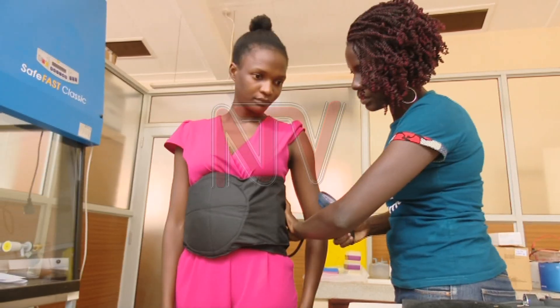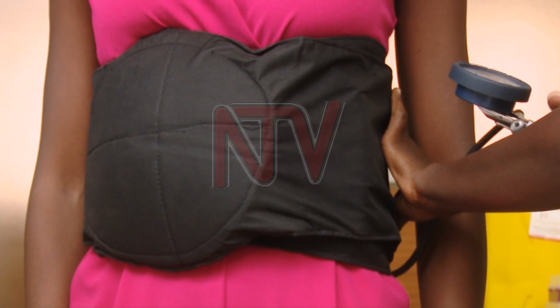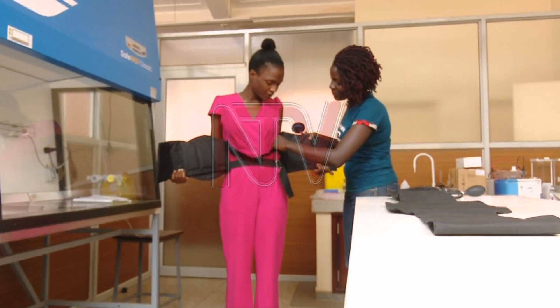There is a slight increase of pressure in the abdominal area. They did a 3D computer-aided design and took dimensions of different women — from the largest to the smallest — because a one-size-fits-all approach would not work for the various body sizes of women.